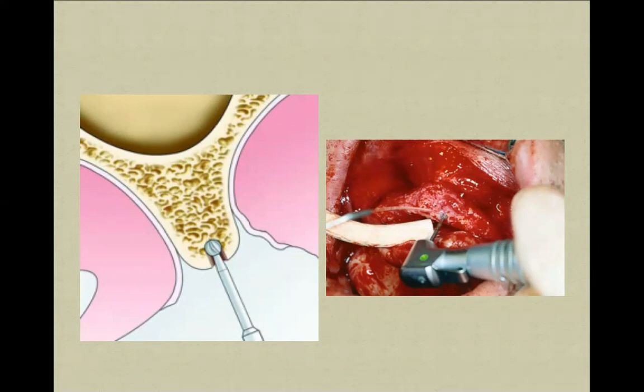You can make holes within this template and use it as a reference to create the final spots on the bone by means of this template.